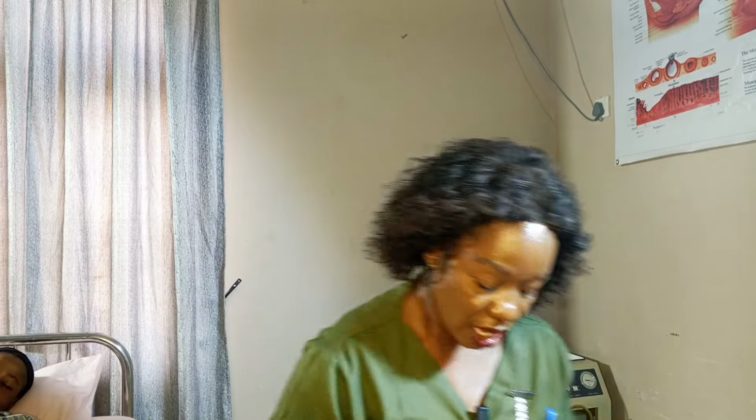Thank you for cooperating. Now that I'm done with this procedure, it is left for me to discard my used equipment, and then remove my gloves and perform hand hygiene. So I will remove my gloves, right? I'm done performing hand hygiene. So I have to dry my hands so that I can document, right? After performing my hand hygiene, I take my patient's medication card and I record 10 international units of insulin given at 10 a.m. and patient is left calm on bed, right?